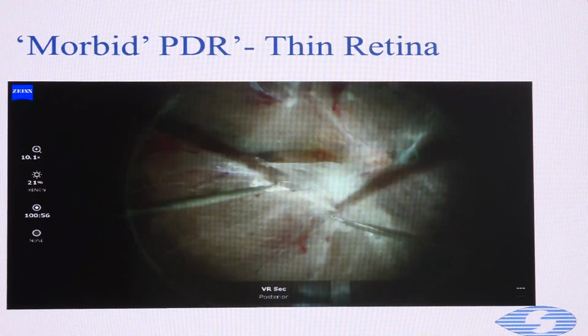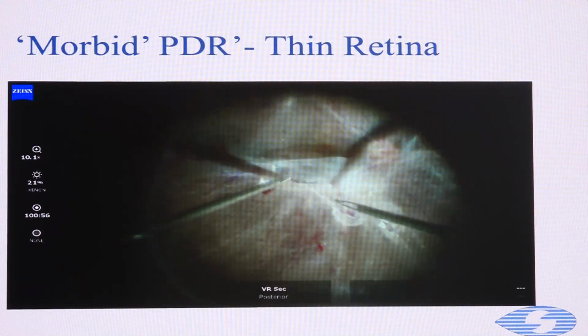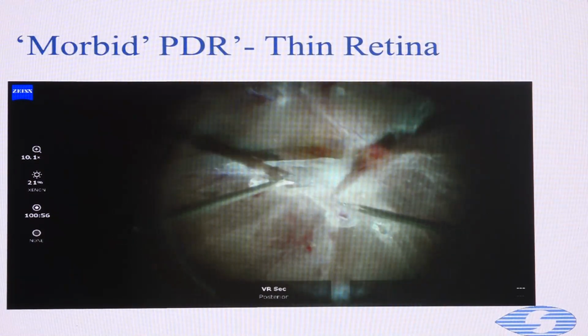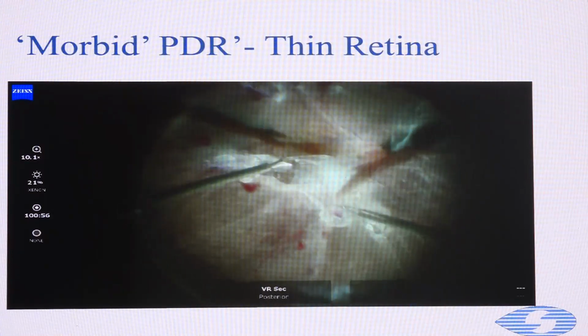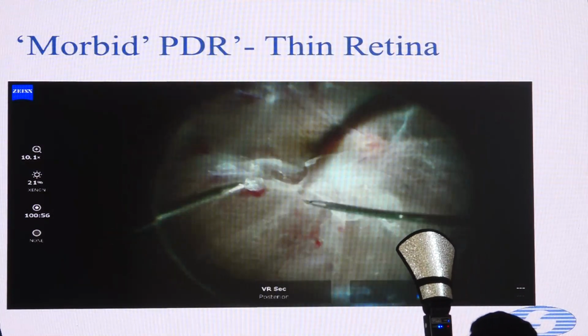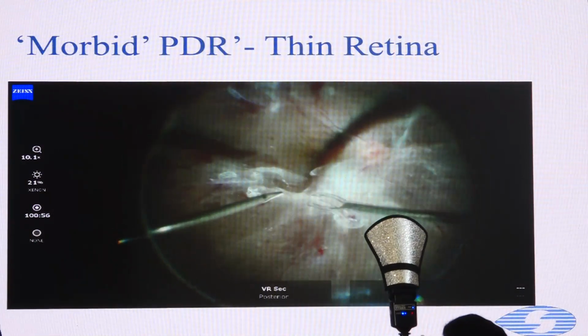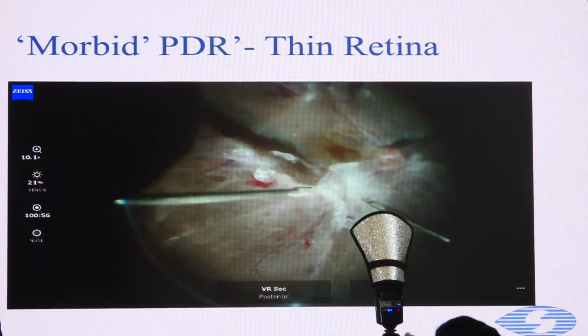You still see a little bit of sheen peripherally, but I think you can probably get into the right plane again over there, and we'll handle that one membrane peripherally and go from in to out. And then finally getting into this plane.